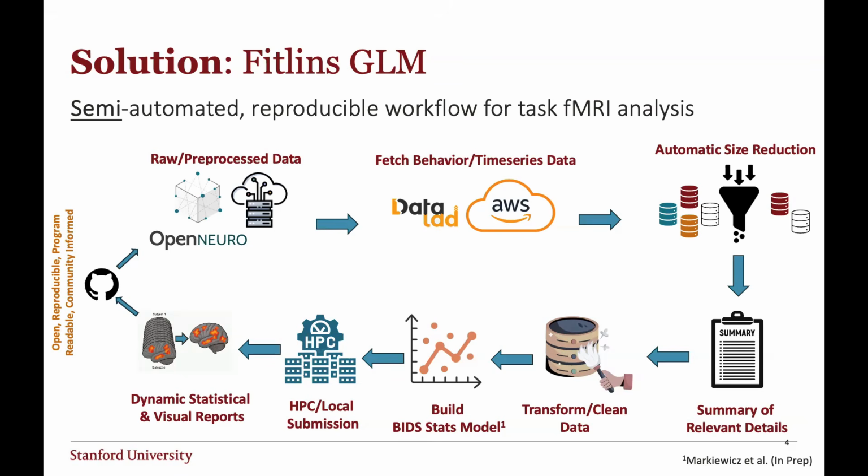Obviously, we're also trying to reduce compute time by pushing all of the task-based analysis outputs to S3 buckets so people can download them easily and not have to rerun anything. But we're still working on that. So there's this whole workflow, a loop that you go through in the pipeline, and all of it is achieved in 5 bash commands, which I'll cover a little bit later.